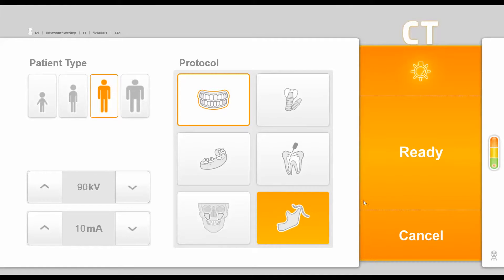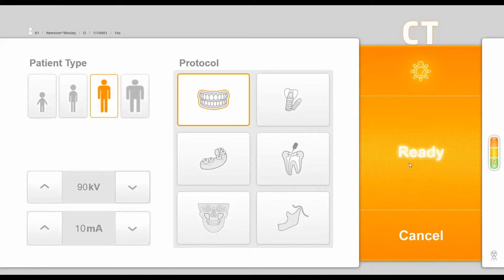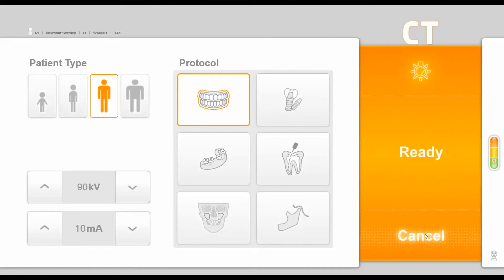On the right side in the orange, we can turn on our positioning lasers, we can ready the unit, or we can cancel out of this interface. Once we've made the desired selections, we can click ready, or we can position the patient and then click ready once the patient is aligned.